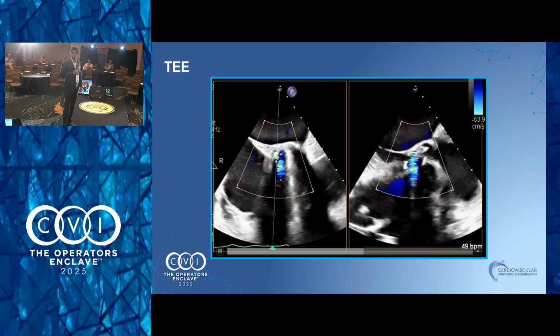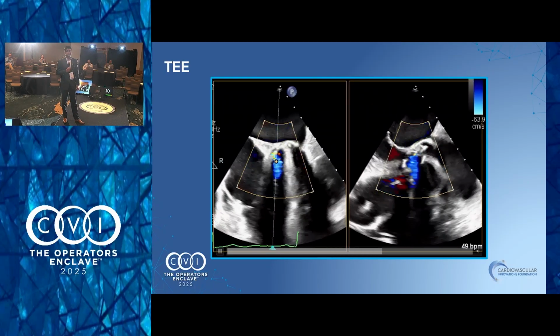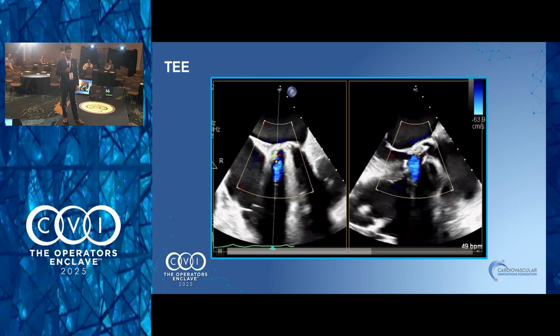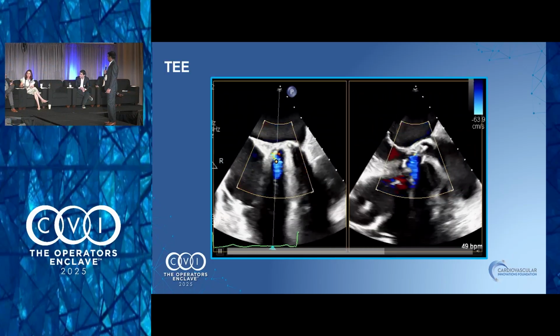I agree, it has to be somewhere close to the suture line. So either the aortogram, or if you can just close it retrograde from the aorta. I mean, the easiest thing would be retroaortic. Yes, but it's about defining the entrance, and ideally you do it in biplane, so you can see it in a couple of views and you're not hunting around for the entrance. But a full-strength aortogram would be the right move. And Nadira, is there any chance this is LVOT?